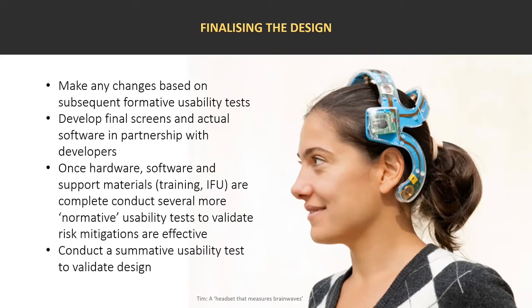Whereas the normative tests allow a degree of interaction from the researchers. So you're allowed to prompt respondents to try and understand what their mental state is, if they're getting confused, if they're needing more information. So it's really a collaborative endeavor, and that all funnels up to a single, final design, which is the summative test.